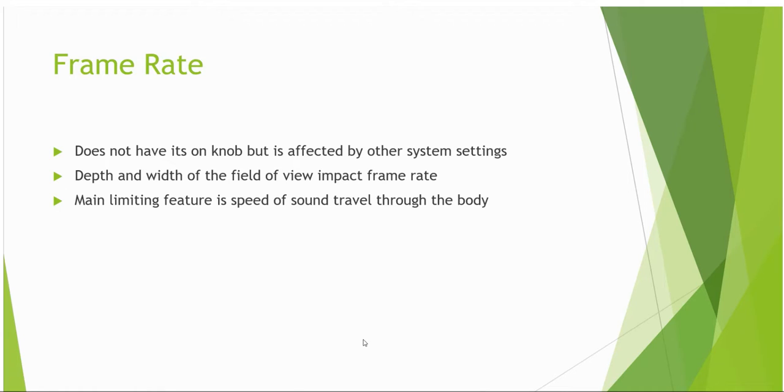A similar problem exists when we increase the field of view and add more lines of sight. By adding these additional lines of sight, we need to wait for the operation of these to complete before the system commences a new sweep of the sector. Therefore, again, the frame rate will decrease.